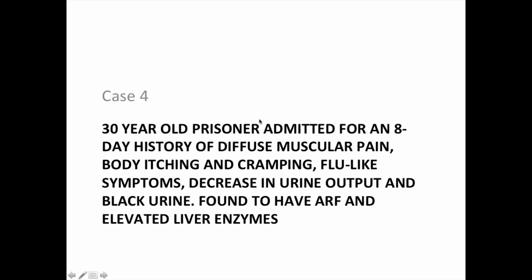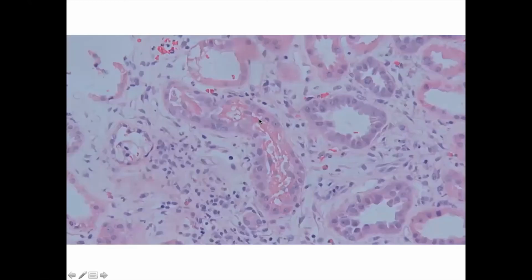They did a biopsy. His glomeruli were absolutely normal, nothing wrong with them. But they saw that he had acute tubular injury. There was flattening and loss of the brush border of the epithelial cells, flattening of the epithelial cells, and then we had casts. These casts.